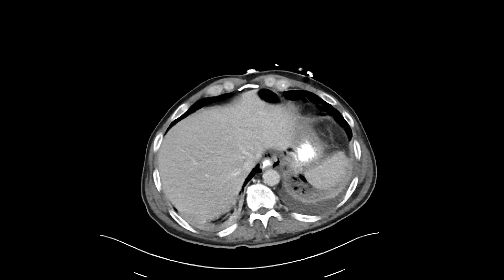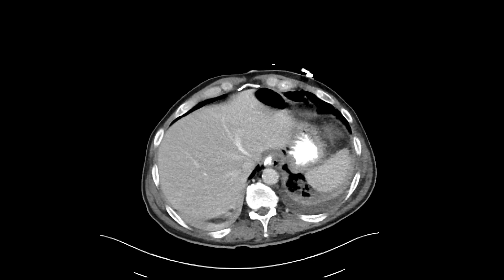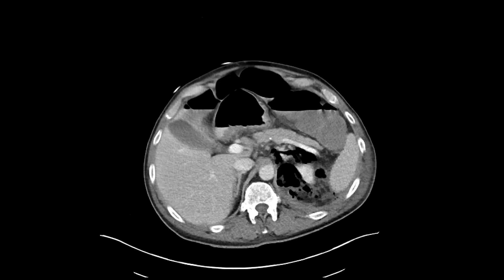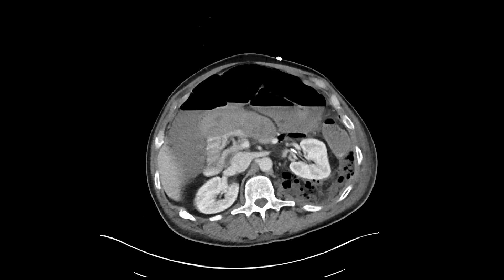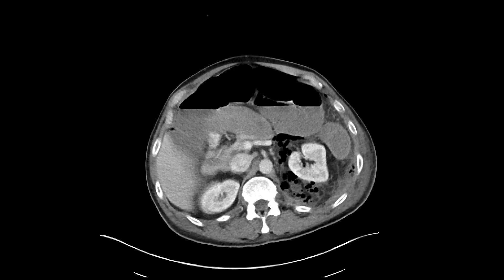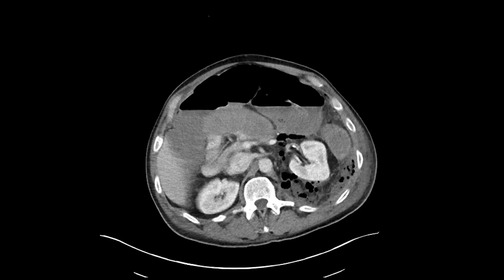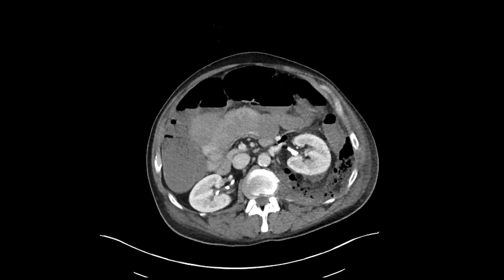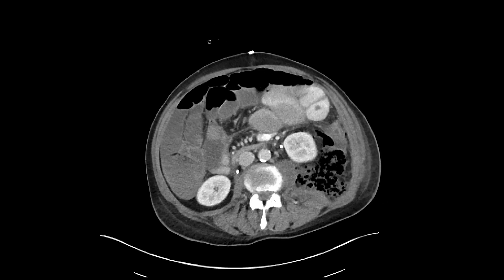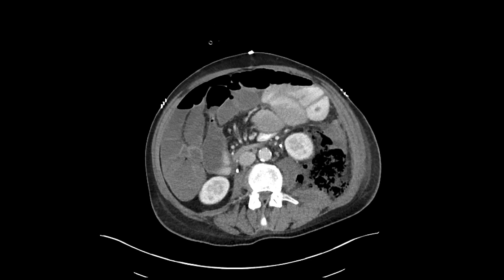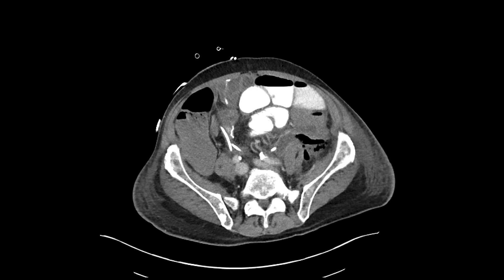We can already start to see in the first couple of slices there's gas surrounding the distal esophagus. And more below, there's more pronounced retroperitoneal gas and fluid surrounding the left kidney in the left perinephric space. There are also distended loops of bowel.